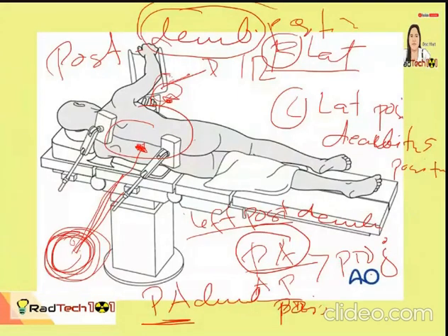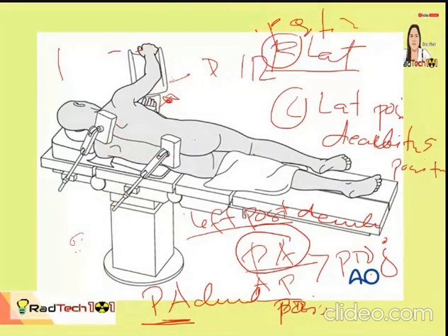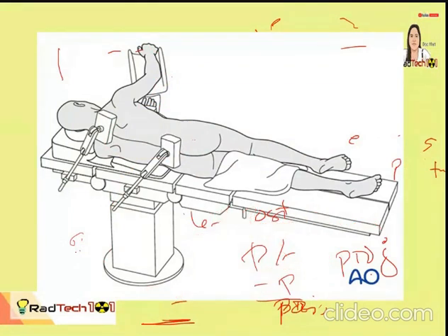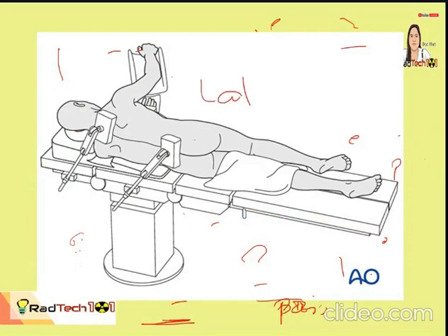As you can see, the patient is lateral. Meaning, when we say lateral position, the patient is lying on his side.